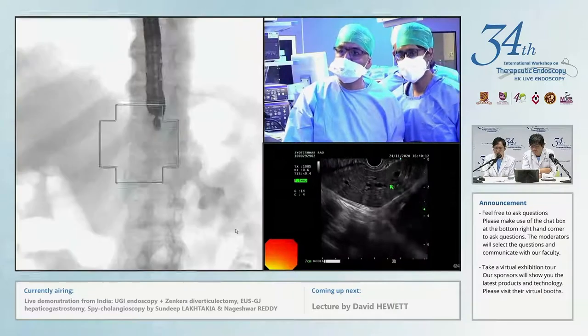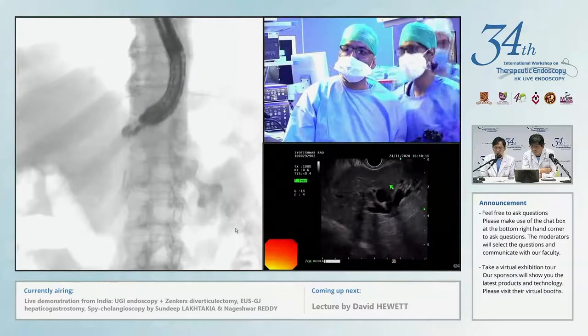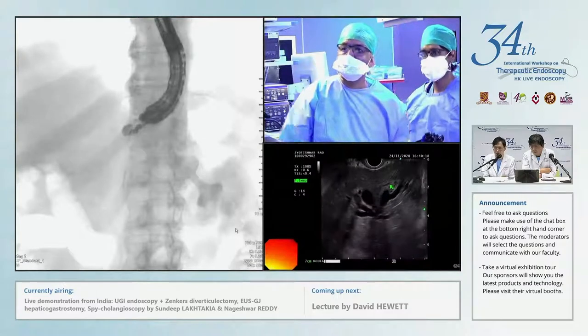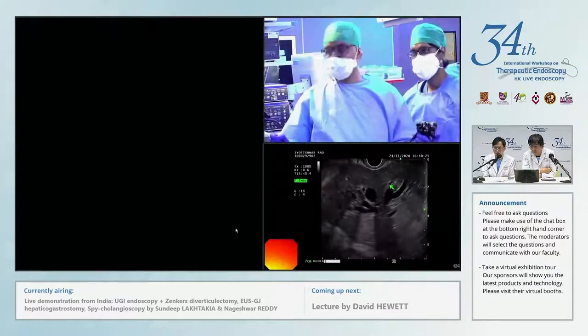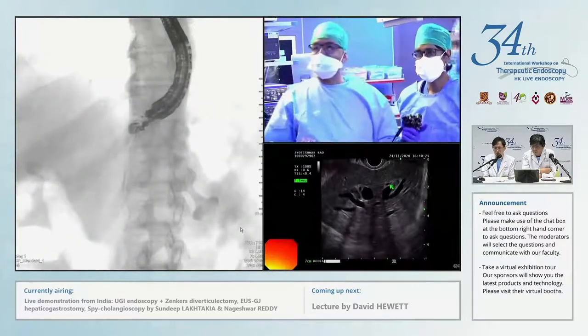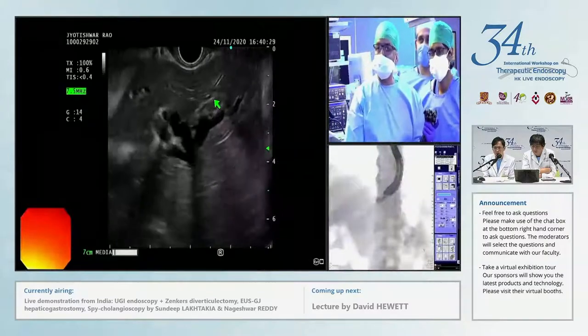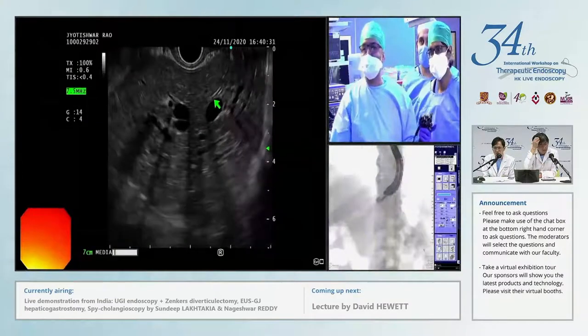Right, screen, please. This is better. This looks better. Can I have the needle now? So this is a very good position. Jahangir helped me in finding it out. You agree, Asif? Yes, sir. So it's very important to be on the same page in the room.